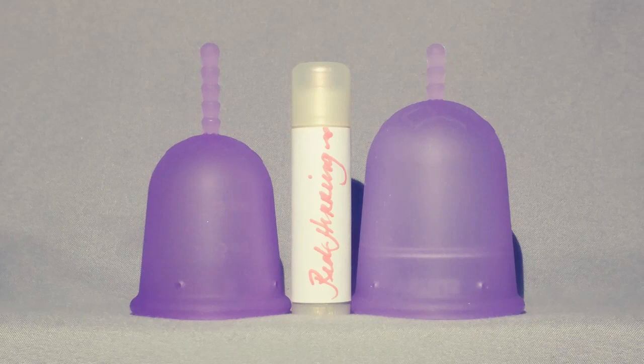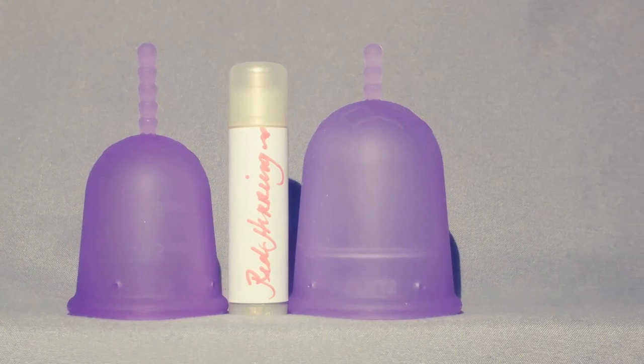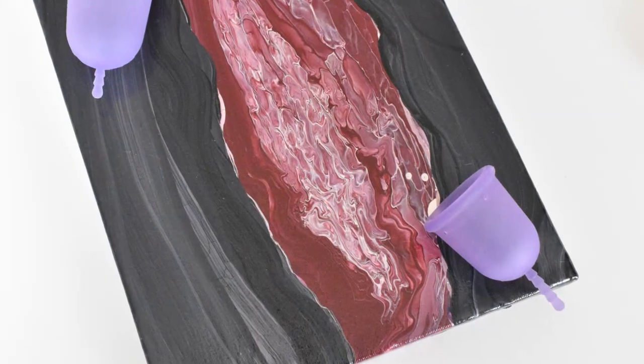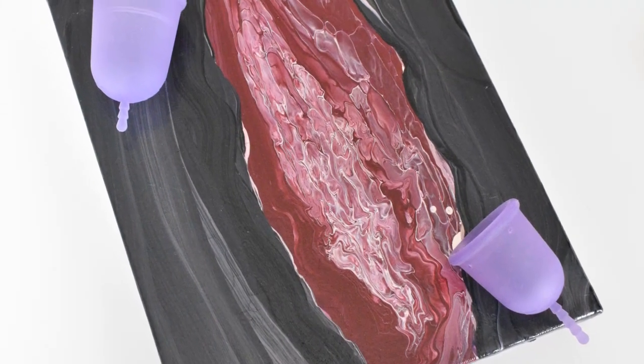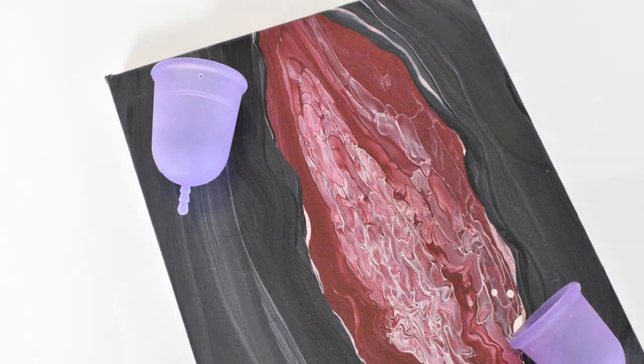I love that the Venus Cup has a high capacity without being too bulky, either too long or too wide. The large Venus Cup would probably be more comfortable and easy to reach for someone who has a medium to high to very high cervix. For those who have a medium to low cervix, the small might be more comfortable. However, if you have a very low cervix I think it still might be a little too long.